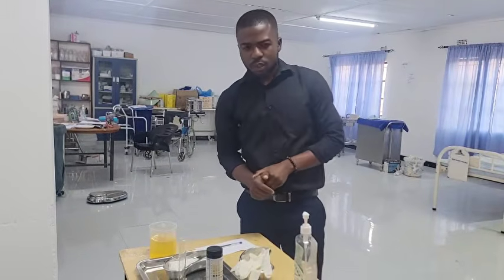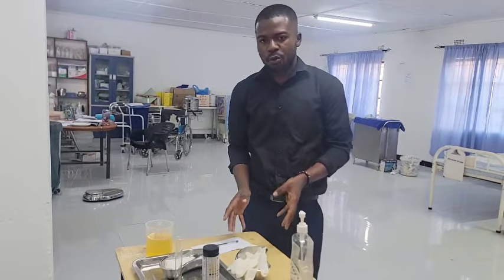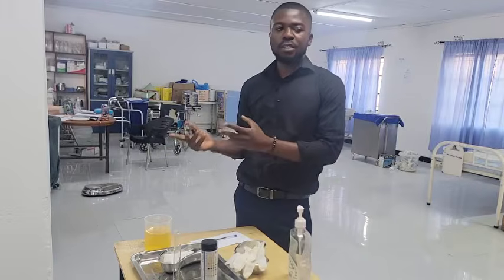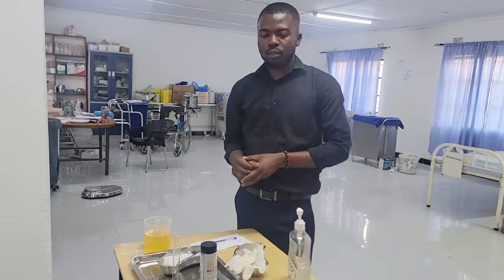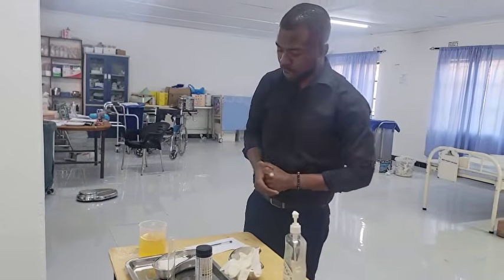Yes. So now, this procedure is a clean procedure. This procedure is performed from the sluice room, or you can simply collect urine and take the samples to the lab so that they can also do urinalysis there. Then you just go and get the results.